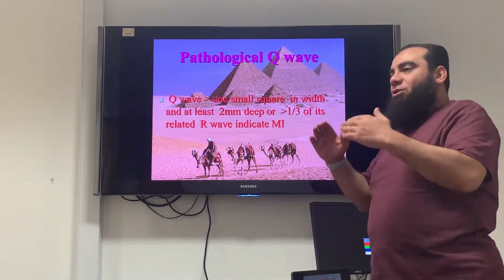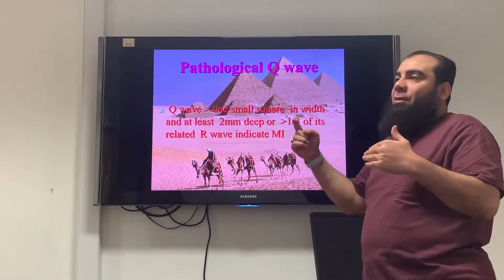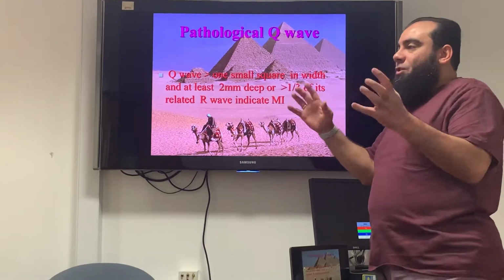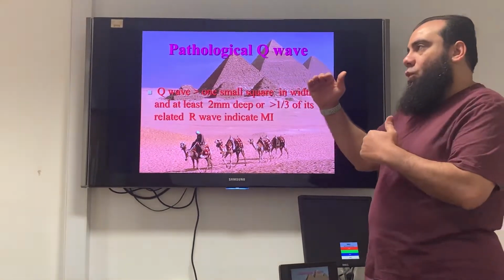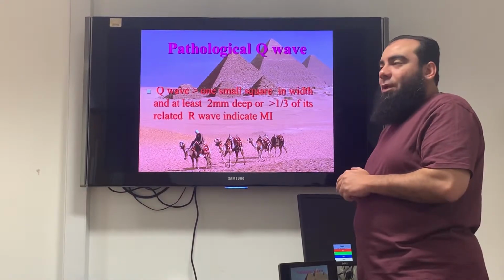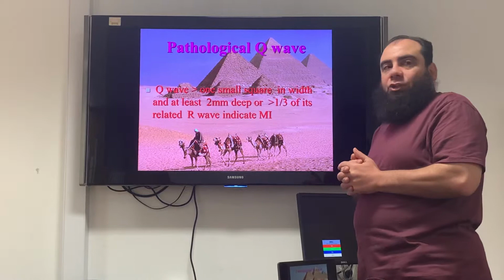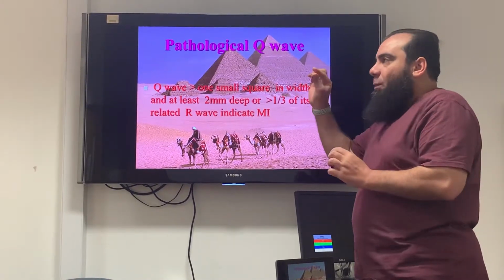Last time we spoke about the QRS complex, normal variations, right bundle branch block, left bundle branch block, right ventricular hypertrophy and left ventricular hypertrophy, and the criteria for all of them. Some of the criteria are actually a bit high level, but we simplified them to a low or basic diagnostic criteria for each one of them.